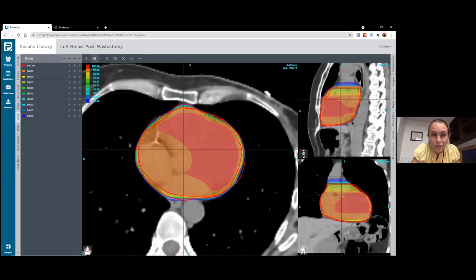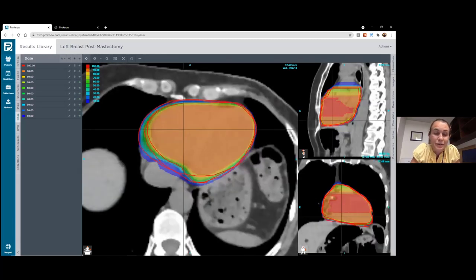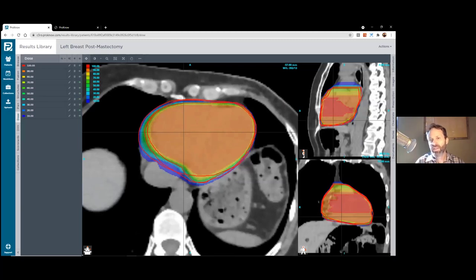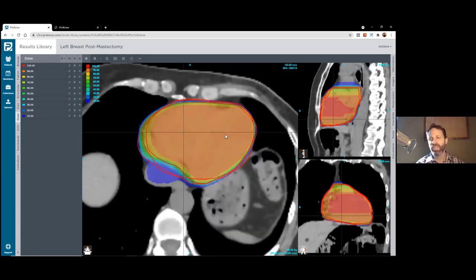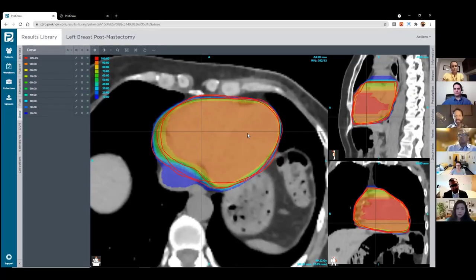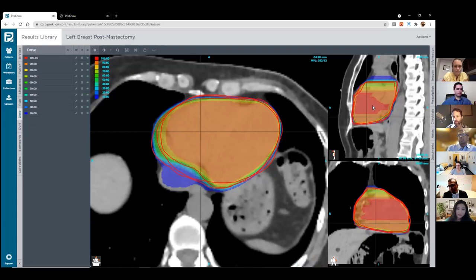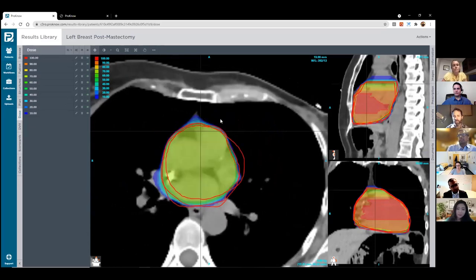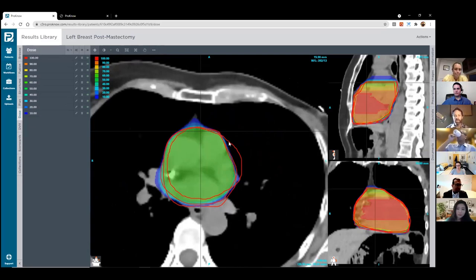I at least struggle — the inferior is usually pretty bad on AI contouring, which aligns with Rachel's point. Some of these datasets we are going to provide to the AI vendors eventually — we just didn't want them at the beginning because comparing their results versus the panelists and the consensus has a lot of value. If I had to pick a consensus percentage that best matched our panelists here, it does seem to be the green, which coincidentally is right around 50%. That also goes for the most variable portion, which is up here at the superior border. So around 50% looks to be a magic number for the heart.